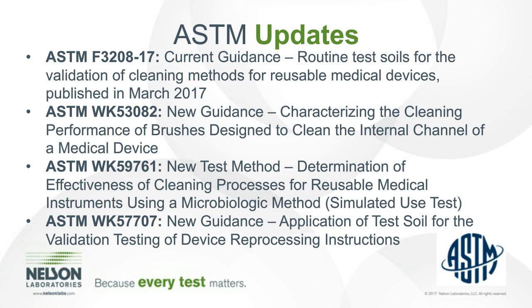meetings. As you can see, I have listed at least 3 working documents and one that we finalized this year. And there's still a lot more to come regarding reusable medical devices. There is a lot of uncertainty out there regarding how to do the validations and how to do the extractions, and what are the criteria for reusable medical devices and acceptance criteria.